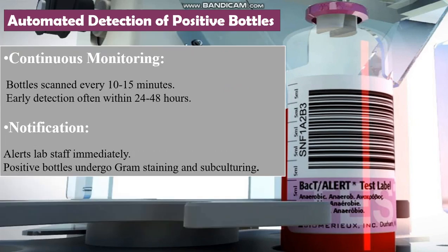These systems continuously monitor each bottle, scanning every 10 to 15 minutes. This real-time detection allows for early identification, often within 24 to 48 hours, significantly reducing diagnostic delays. When a bottle is flagged positive, the system alerts lab staff with sounds and visual notification. Then the bottle is removed for further testing. This will include gram staining and subculturing to identify the pathogen and determine the most effective treatment.